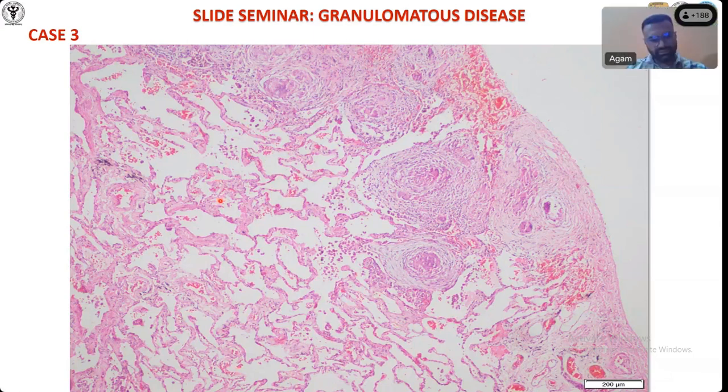Perfectly normal. So the first thing all of you should remember is to try to identify the tissue first, from where the biopsy has come. If it has come from pulmonary, obviously you will know that it is from lung, but most of the time, as ma'am said, it will be from surgery where they will not even write anything on the form. You have to assume. So as a resident, you have to identify the parent organ and tissue first. Fine. This is a lung. You are confirmed that it's a lung? Yes, sir. Do you see alveoli in any other organ other than lung? No, sir. Okay. Then what do you see?